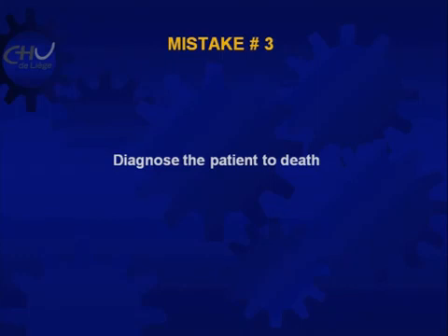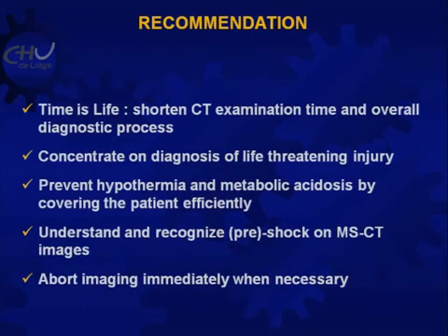Time is life. Shorten the CT examination time and overall diagnostic process. Concentrate on the main diagnoses which are life-threatening and also prevent hypothermia. And radiologists very often are contributing to hypothermia because the patient is feeling too cold in our examination rooms. And hypothermia influences metabolic acidosis. And metabolic acidosis has a negative influence on coagulation. So just covering the patient and keeping them warm in radiology contributes already a lot to the management of these patients. And then you have to recognize on the images what shock means.